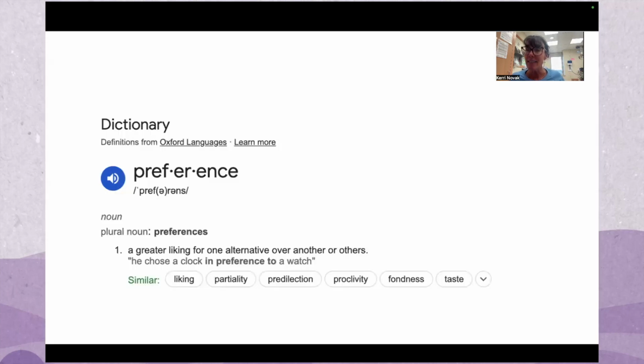What about the second A, which is acceptability? One of the most important parts of accepting a test is what you'd prefer to have. Many of you who've had 4 liters of Colyte in a colonoscopy, having to take the day off to prep and take the day off to have the procedure, know that this is a hugely impactful test on your everyday life. Having a test where there isn't preparation, you can just do it while you're seeing the doctor anyway, so you don't have to spend the money on another parking ticket, another appointment. You can do it all at once, might be preferred.